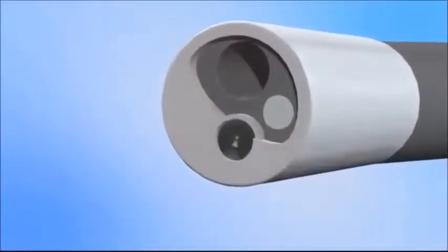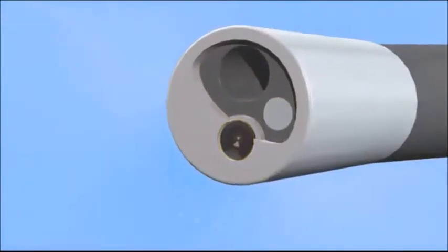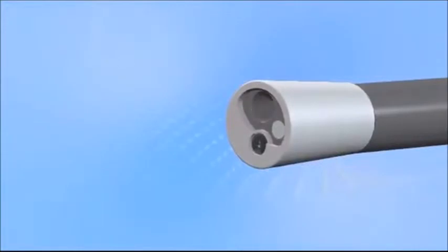The fiber optic channel is sealed by a diamond glass plate which closes the optic channel tightly. Because of this, the fiber optic never comes into contact with the patient and does not need to be sterilized between cases.